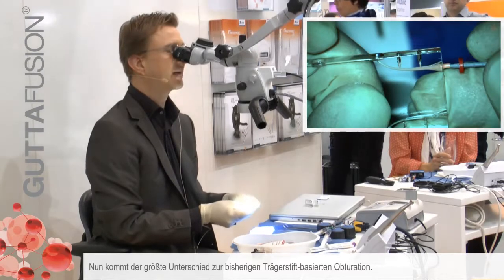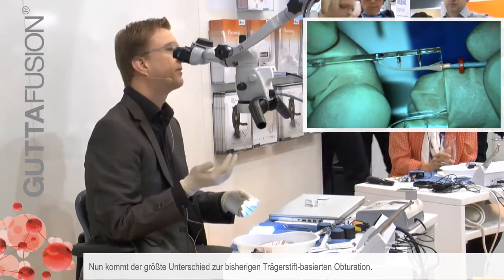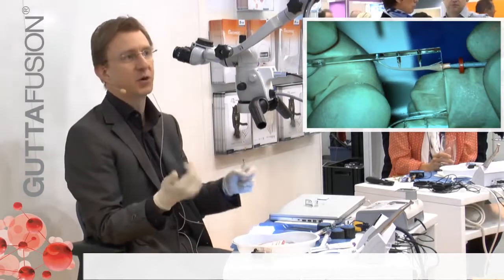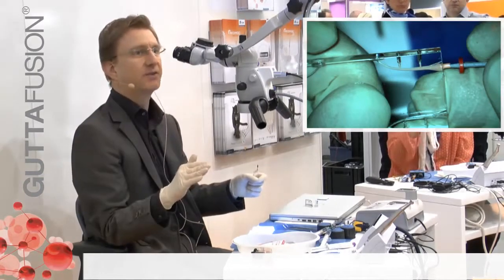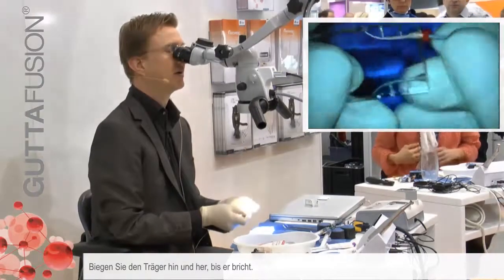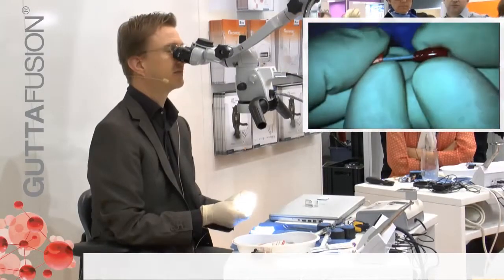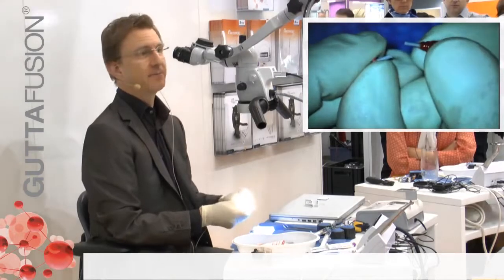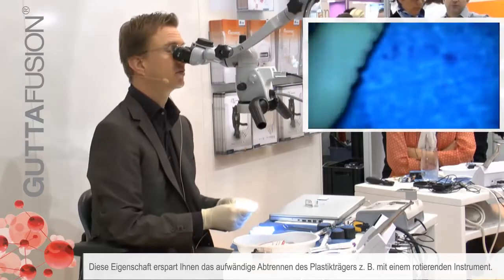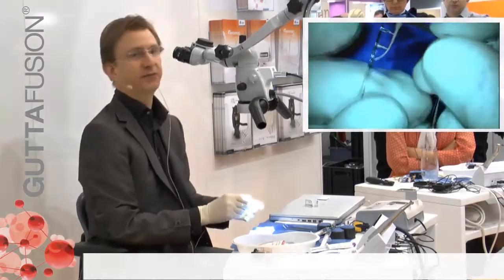Now comes the biggest difference compared to previous carrier-based obturation. Usually we had to use a rotary instrument to cut off the plastic carrier. Now, all we have to do is bend it back and forth — I like to compare it with breaking a spaghetti. This is a nice clinical feature that helps us avoid the hassle of shearing off the plastic carrier.